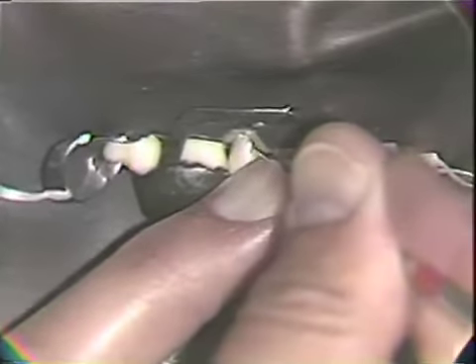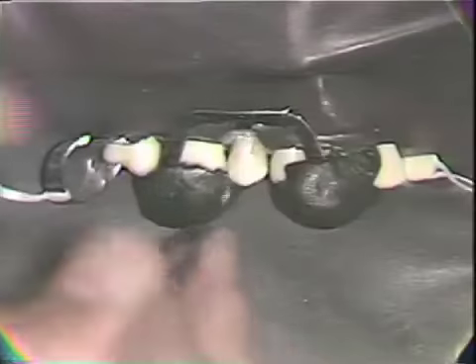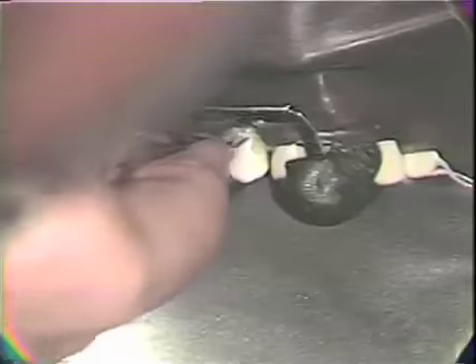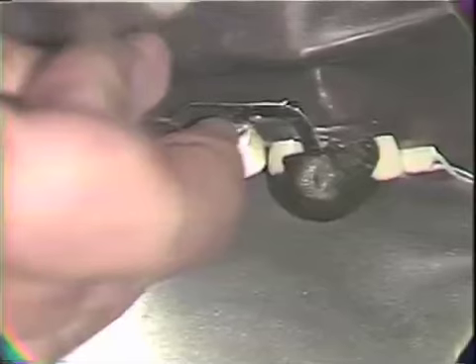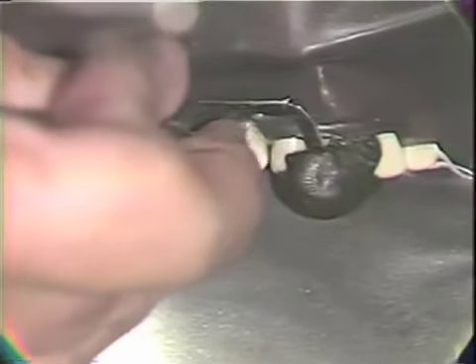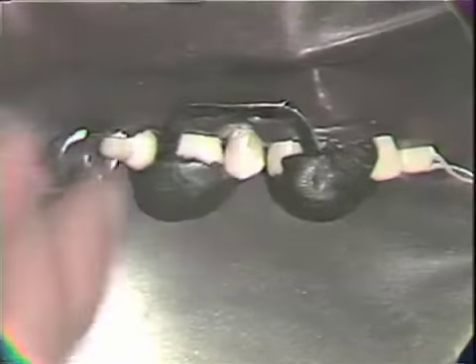I have that area worked to the mesial, then go ahead and work the distal aspect of that wall in a similar manner. Again, it's a cervical extension of that wall, not a deepening in a pulpal direction.